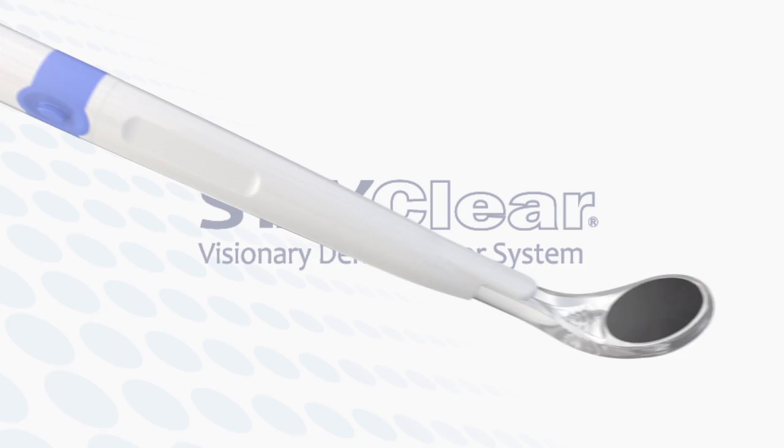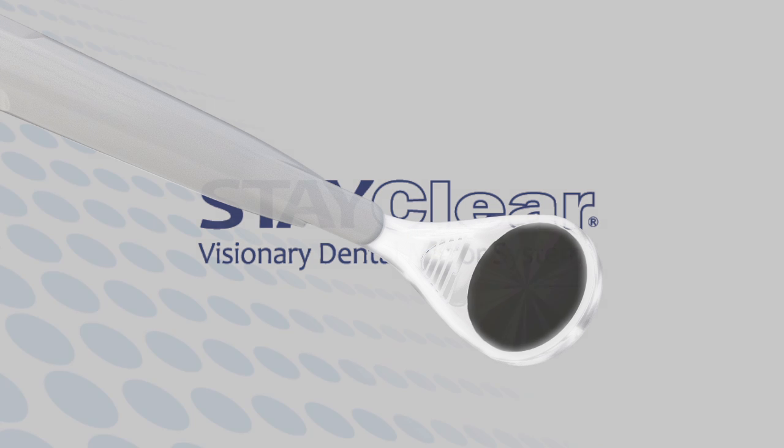Light and air are delivered and directed through this cable. Now, let's assemble the handpiece.